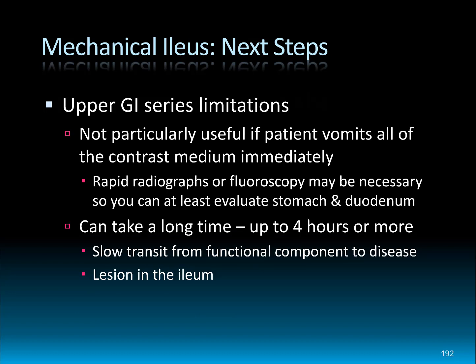There are, of course, limitations, as always. One is that if the patient is vomiting all the time, he or she will puke out all your barium, and then you're not going to get a good study, so that can be a problem. And then the study can take a long time. It can take hours before the contrast medium gets all the way to the lesion in question, and so you're accepting the fact that you're going to be waiting a while for a diagnosis, and even if you get a diagnosis, all of a sudden now it's 7 in the evening and you've still got exploratory surgery ahead of you.